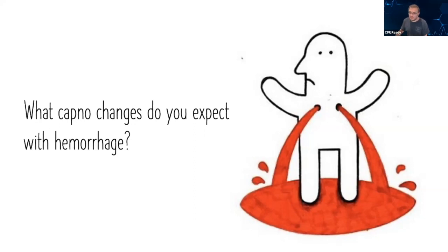What do you guys think for your trauma patients? High. Okay, I got high. Anyone else differ? In the chat here, lower perfusion equals lower capnography.